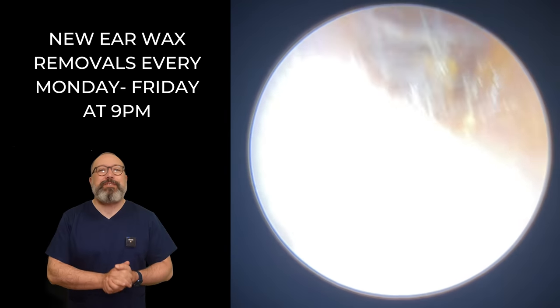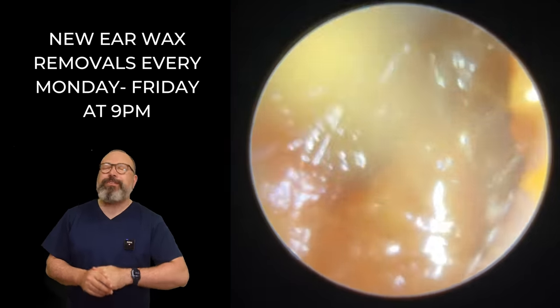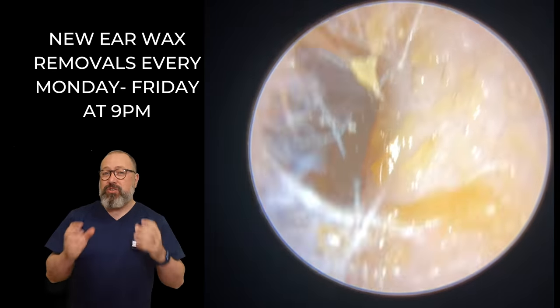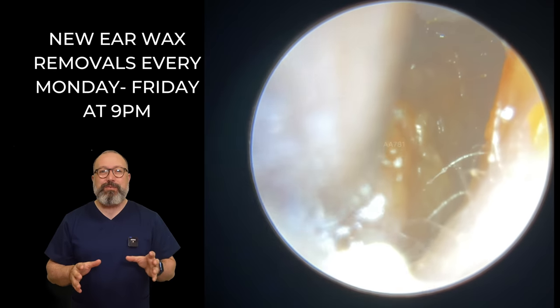Hi everybody, my name is Rhys Barber. I'm the audiologist here at Audiology Associates. Thanks very much for watching our earwax removal compilation video today. Two patients in this compilation video. You can see this first patient's wax looks nice and soft, but not too soft. So it looks like an ideal wax removal, this one.